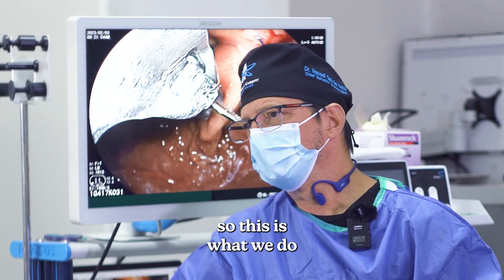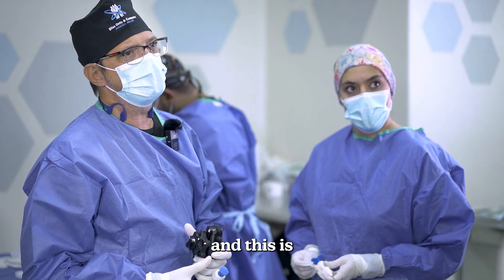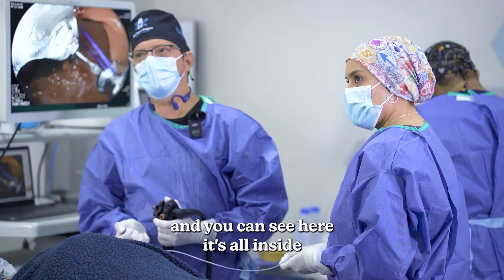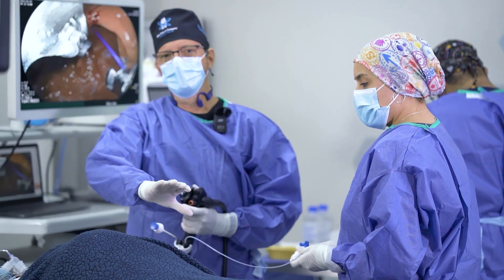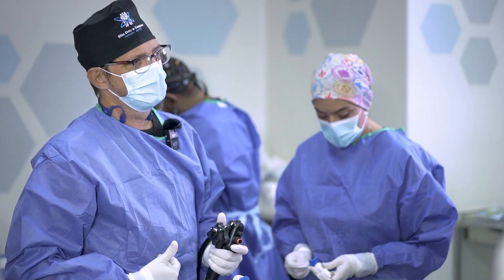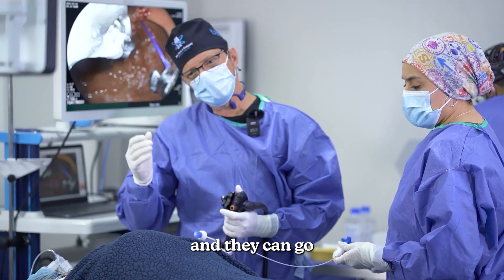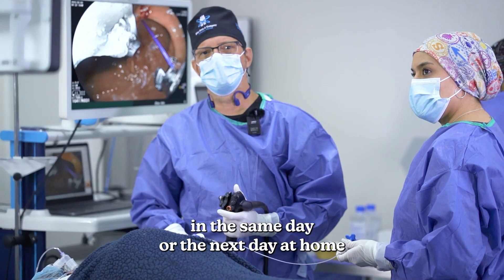This is the equipment that we use to do the endoscopic sleeve gastroplasty. You can see here it's all inside — there are no incisions on the patient. The patients go to recover and they can go home on the same day or the next day.